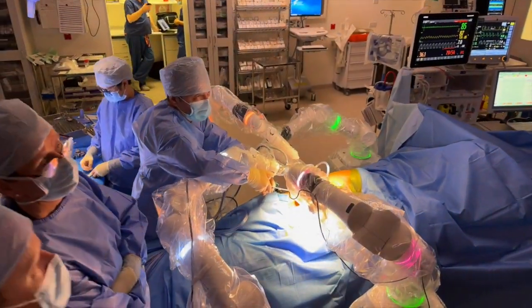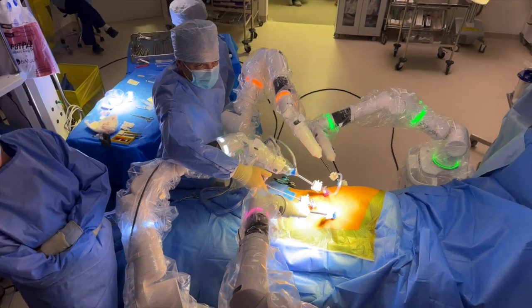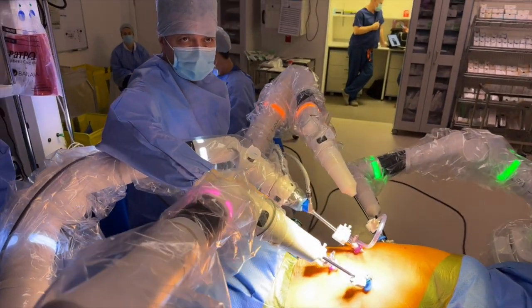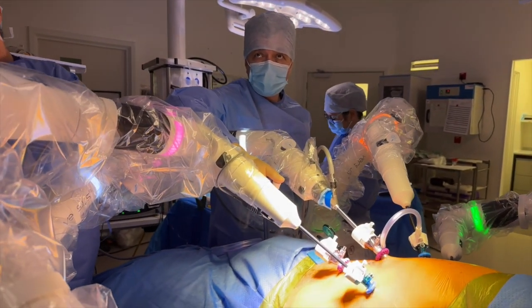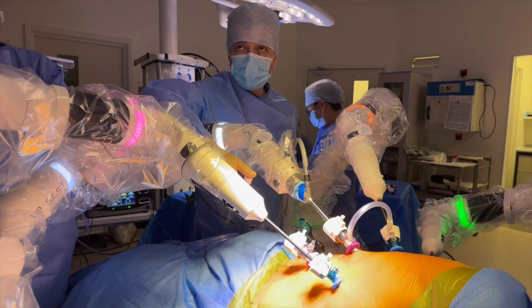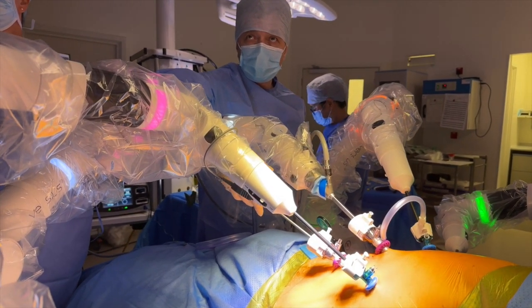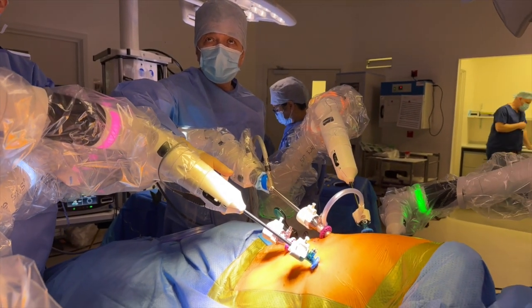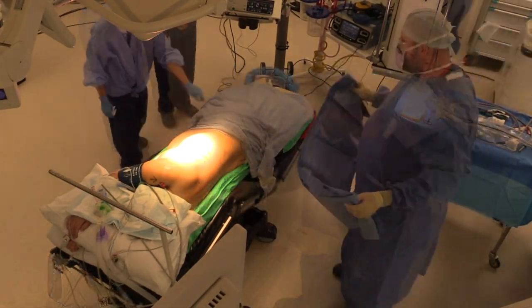Welcome to the Royal Papworth Hospital in Cambridge. My name is Joel Dunning and I'm delighted to bring you this video of their first experiences of the Versus totally endoscopic robotic lobectomy technique. This is Giorgio Solli at the bedside and we have Adam Perrett on the surgeon console. The full team also consists of Amankuna and Giuseppe Aresu at Papworth.